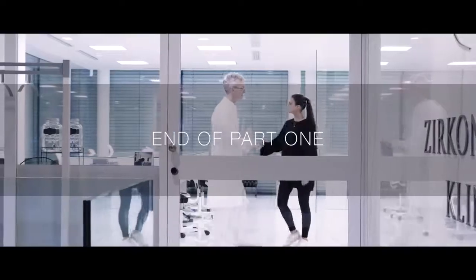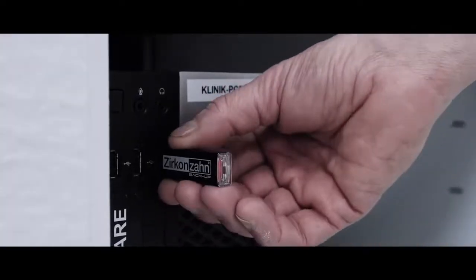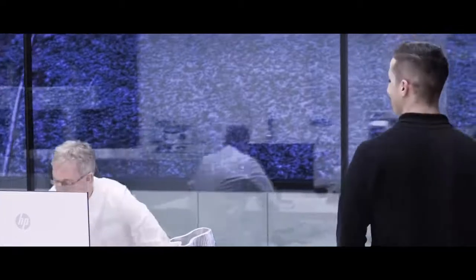At this point, the registration process of patient data is completed. The doctor collects all the data acquired and delivers them to us dental technicians. In the laboratory, we take care of the organization of all data. Using Zirkonzahn's software package, we prepare the basis for the digital design of the restoration.